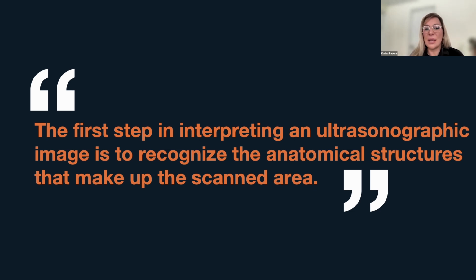So the first step in interpreting an ultrasonographic image is to recognize the anatomical structures that make up the scanned area.